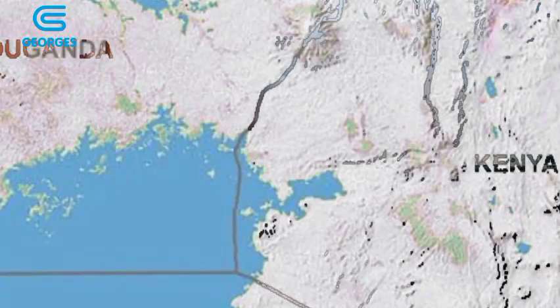Red blood cell distribution width of 6.6, and the reference range is from 11 to 15.0%. So in such a situation, malaria infection, for example, us who are along the tropics and along the lake, there are increased number of mosquitoes around the lake region, Lake Victoria region.